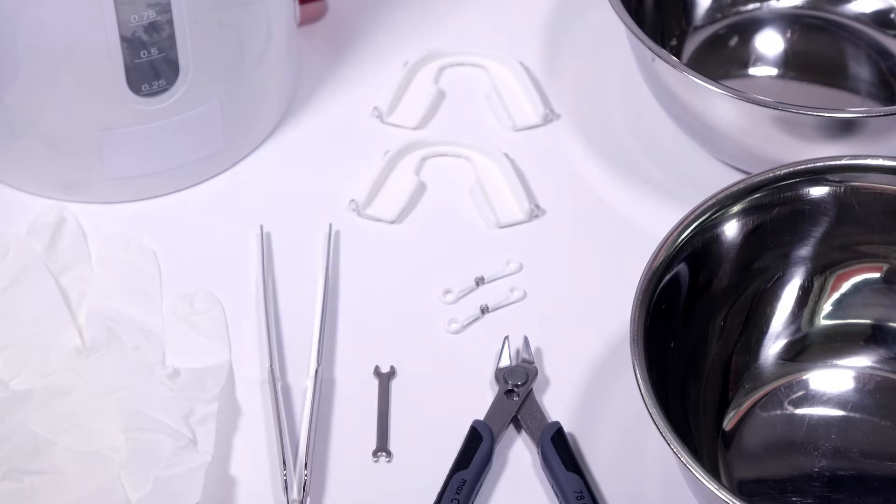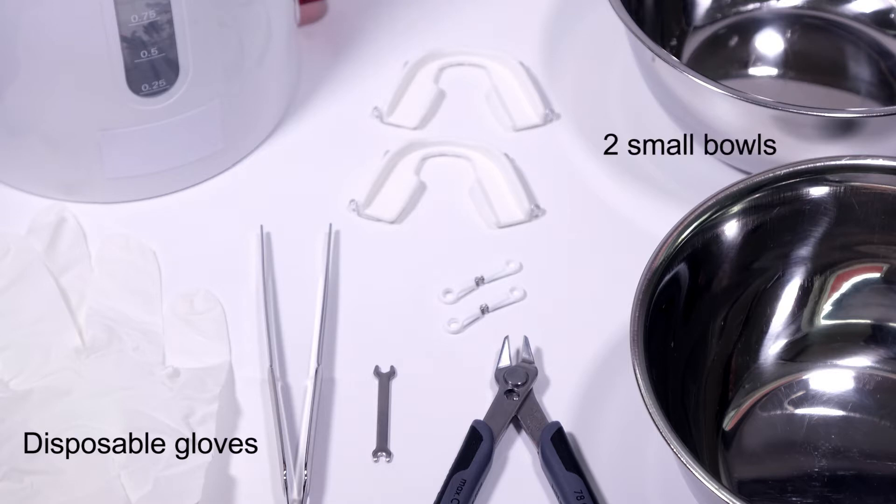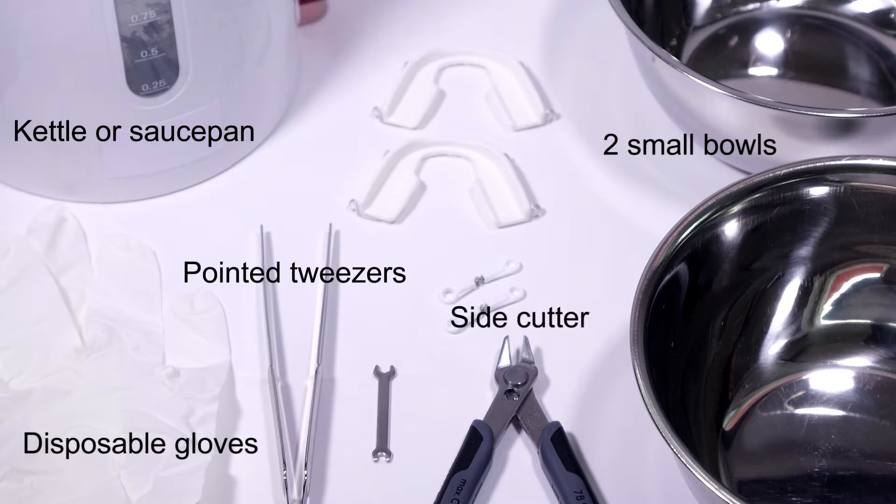You'll need to gather some instruments before you start: disposable gloves — nitrile ones are particularly suitable — two small bowls with a minimum base diameter of 10 centimeters, a kettle or a saucepan, pointed tweezers, and a side cutter.